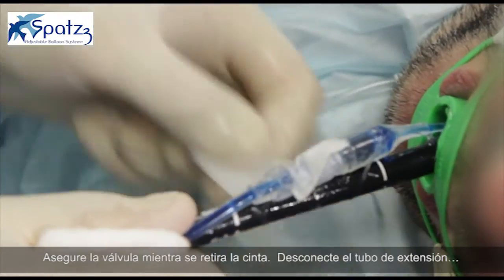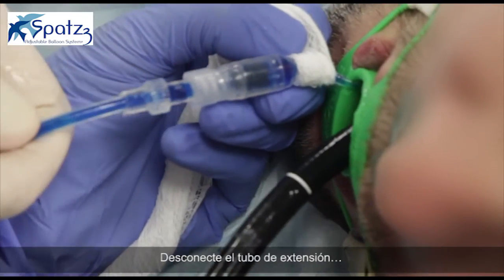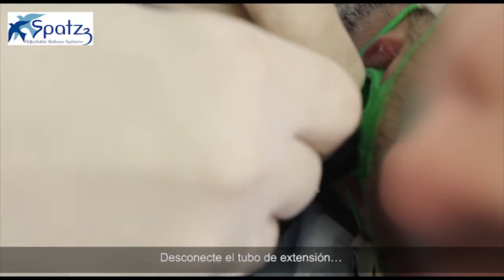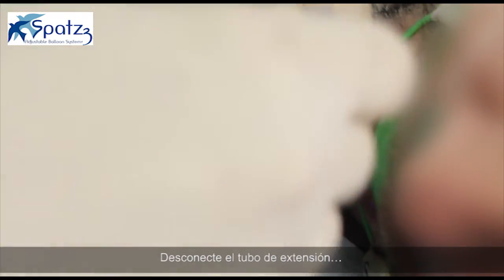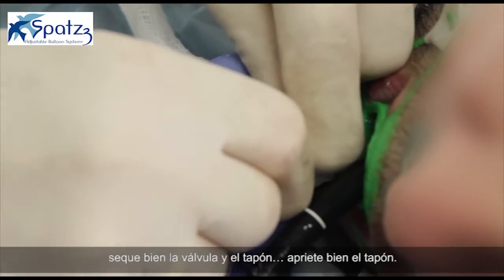Secure the valve while removing the tape. Disconnect the extension tube. Dry the valve and cap well, and tighten the cap in its place.